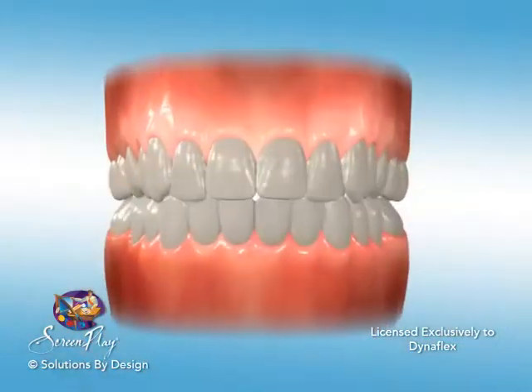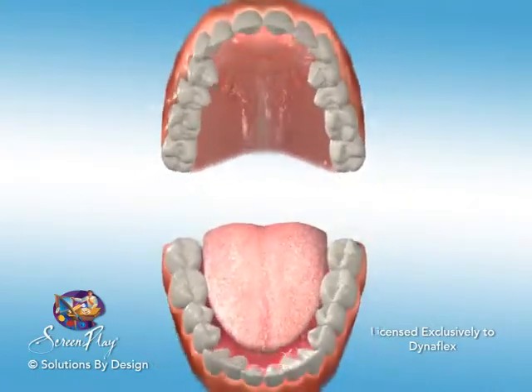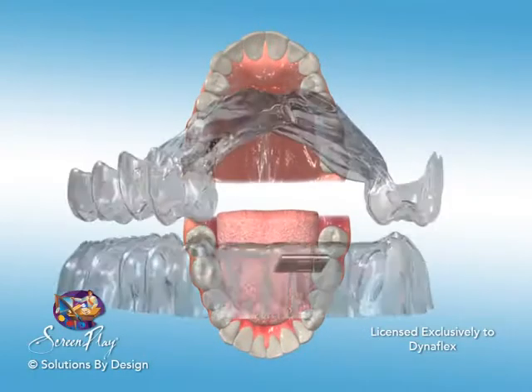The Dynaflex EZ-X is an uprighting appliance that is clear and removable. It is virtually undetectable when placed in the mouth.